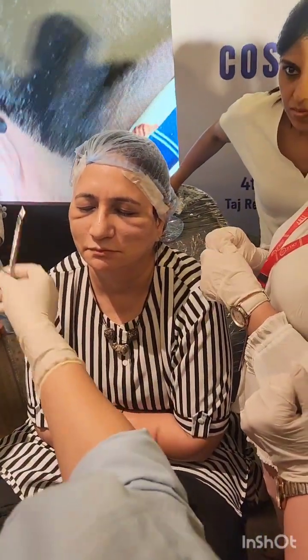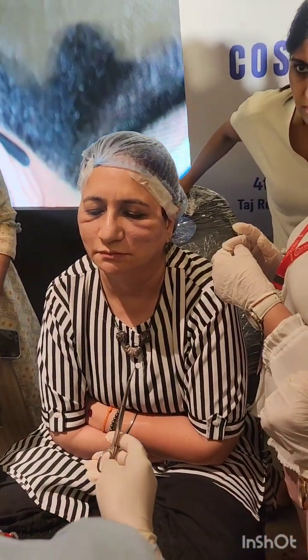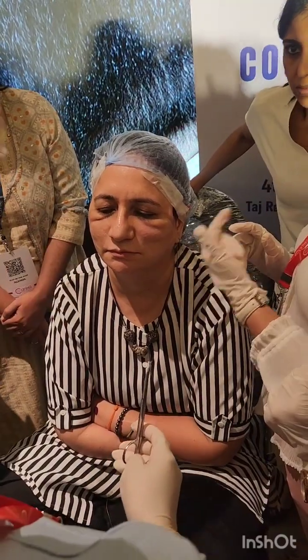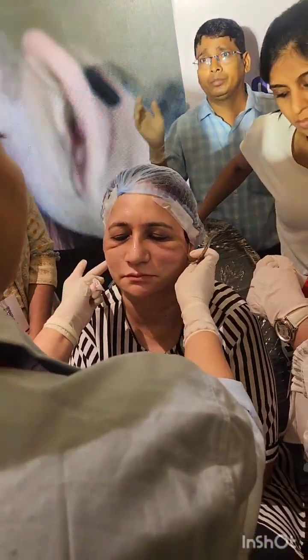This is little less because she already knows that this was more saggier. So if I want to correct that, probably I can do more threads for her. So I'll do it later, but first let me correct her jawline.